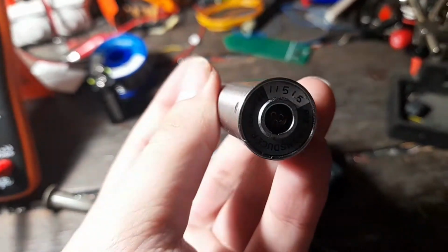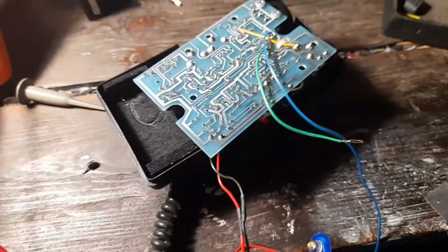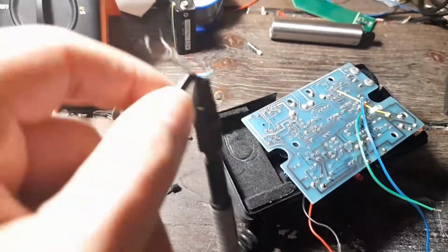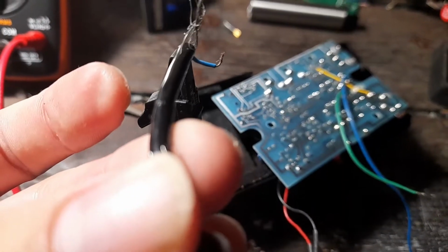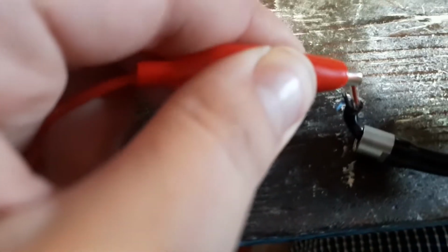Before messing around with the transducer, I tested again the cable, and it turns out that the problem is actually, as the first assumption, in the cable. As you can see, I'm in continuity mode here, and by just playing around with the part here, it's very intermittent. The connection is interrupted somewhere along the cable, and maybe it's somewhere around here. So this explains the weird behavior. So I cut the piece of cable that had the problem, and now there is constantly continuity. No problem.